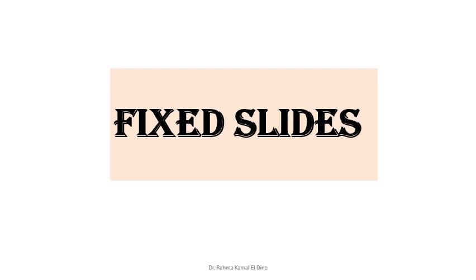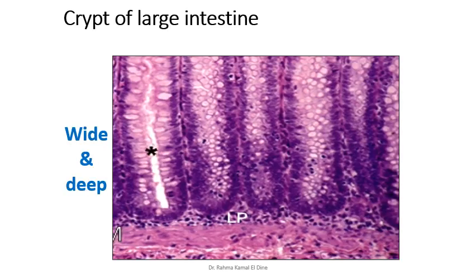If I have a slide in the exam, a fixed slide, you're not allowed to move this slide. We have crypts of the large intestine, which you know by the wide, deep crypts full of goblet cells.